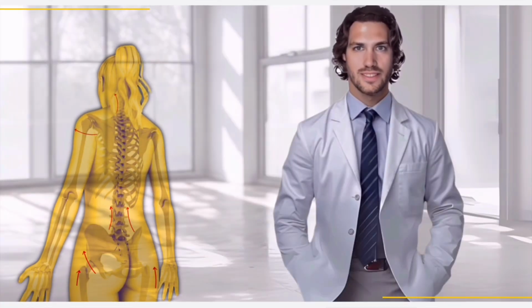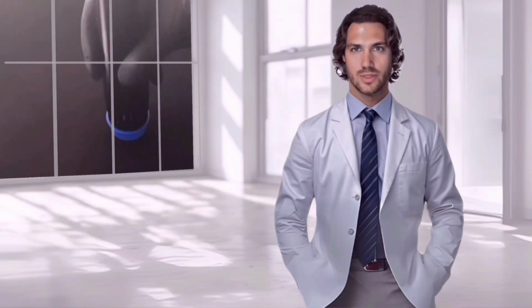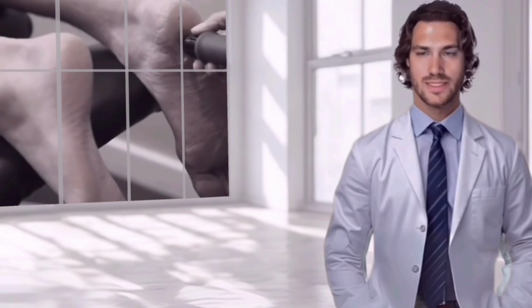In contrast, global shockwave application technique is dynamic, emphasizing circulation, tissue disruption, or intracorporeal movement. Providers often hold the shockwave applicator by the shaft for optimum control. Global technique examples: plantar fascia, skin tightening.